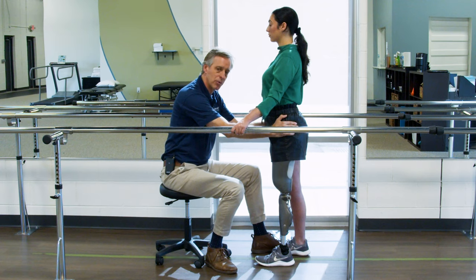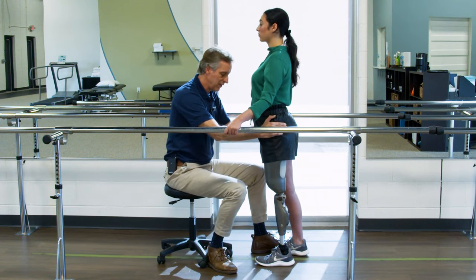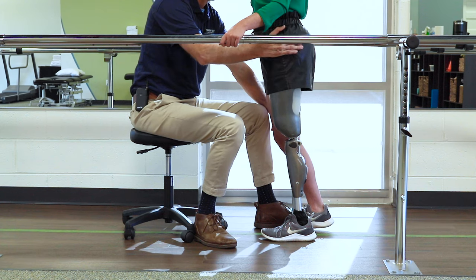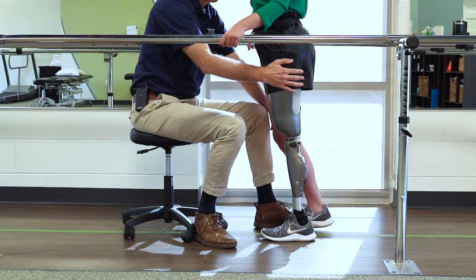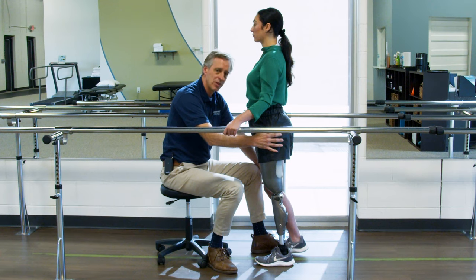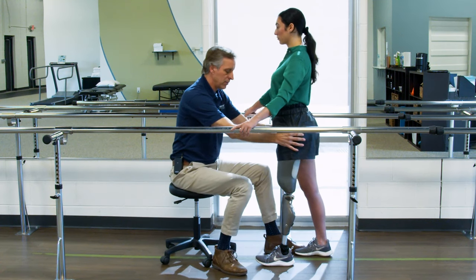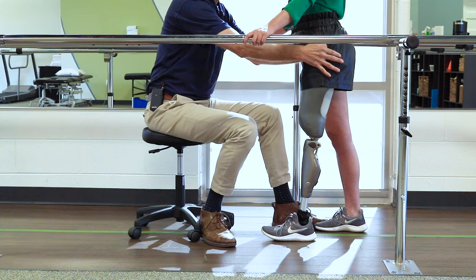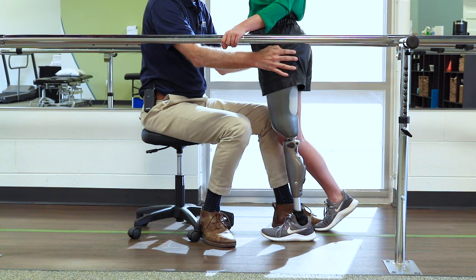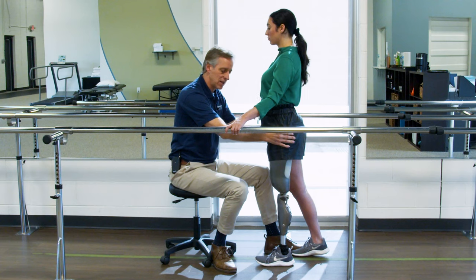We're going to use mirrors to help Tracy see as she comes forward to get that pylon vertical — that's what we call mid-stance or pylon vertical. Once it's vertical, the next level of commitment is relaxing her other leg, which is called pre-swing — normal gait. To relax that knee she has to fully commit her weight to the prosthetic. So Tracy, shift your weight back, give yourself a little room to work. Now bring your weight forward all the way into pylon vertical, and relax your other leg. This is a neutral, stable position; if she doesn't get all the way to pylon vertical she won't be completely balanced on top of the prosthetic.